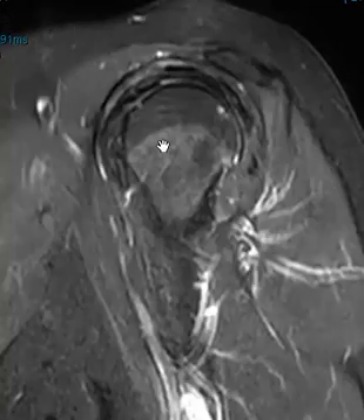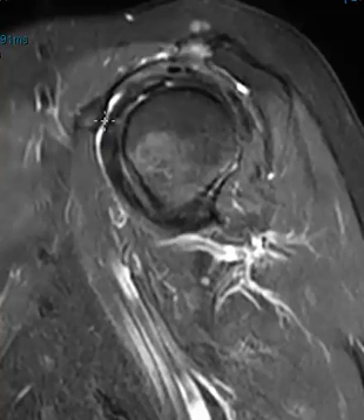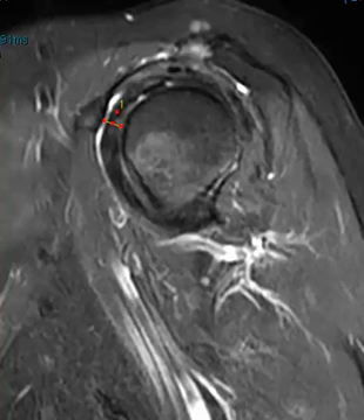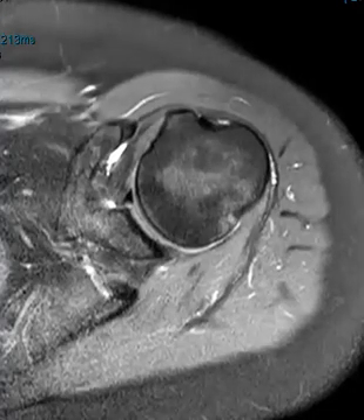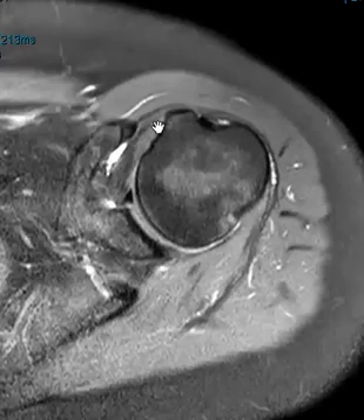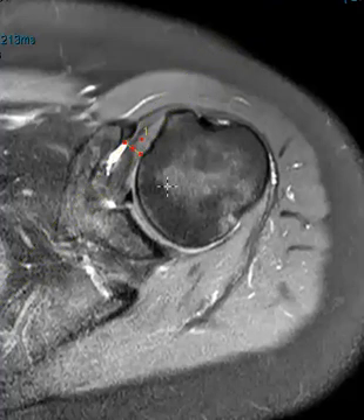Now we're going to look and see how far the coracoid process is from the lesser tuberosity, to see if this may be getting pinched — because the first thing you think about when you see findings right here. Normally it's a centimeter or more, and this one measures five millimeters, so definitely narrowed. I usually think of anything under eight millimeters as really suspect — seven or eight — but in the books they say sometimes ten or less is abnormal. And this is again the coracoid process, here's the lesser tuberosity. We do see that bright signal in the subscapularis tendon attachment — some tendinopathy, really not as bad as I see sometimes — and if we measure here, that's about six millimeters, so again way less than one centimeter and definitely narrowed.